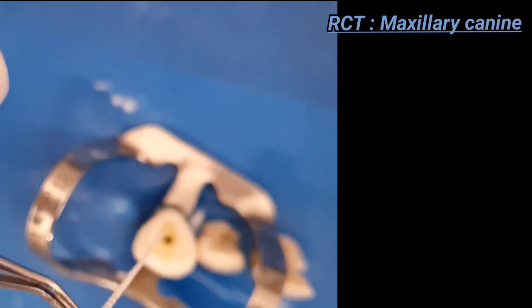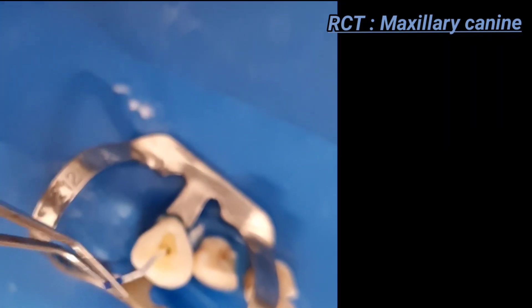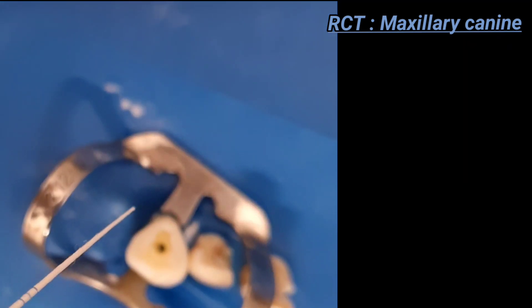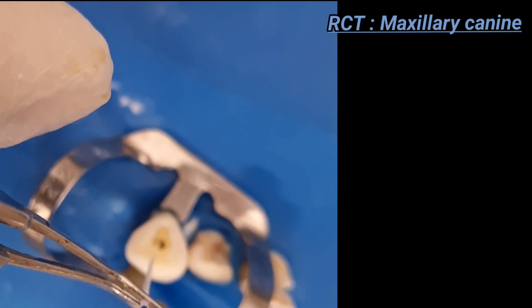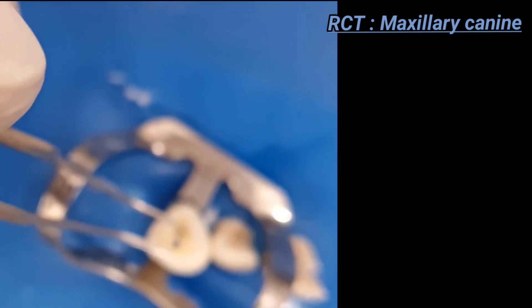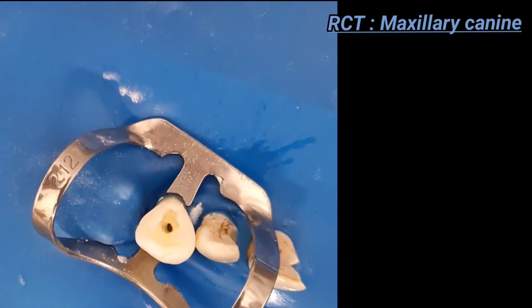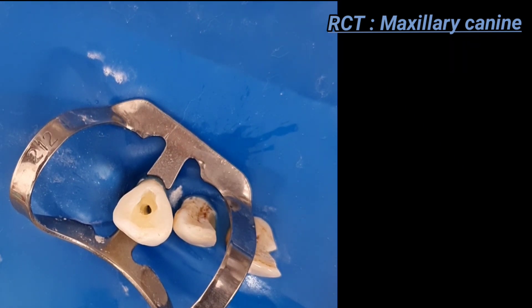Continue inserting paper points as the master apical file to the working length until a dry paper point is achieved. Once the paper point is completely dried — as you can see here — the canal is ready. The canal orifice is then packed with a sterile cotton pellet.